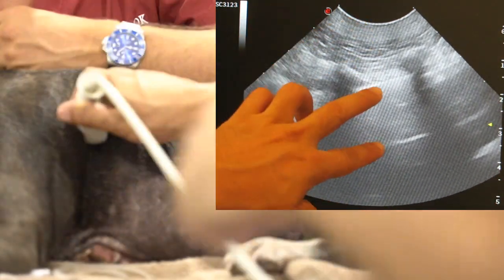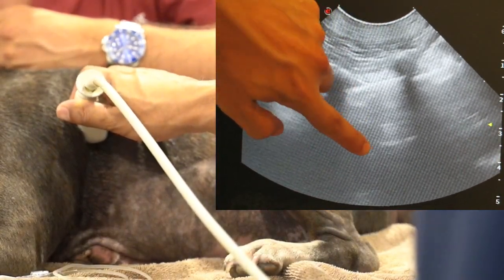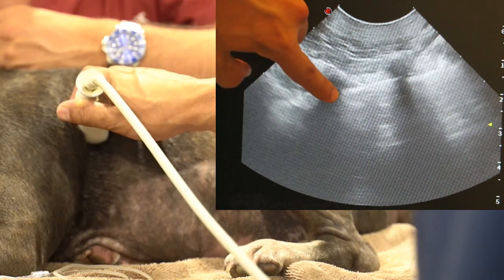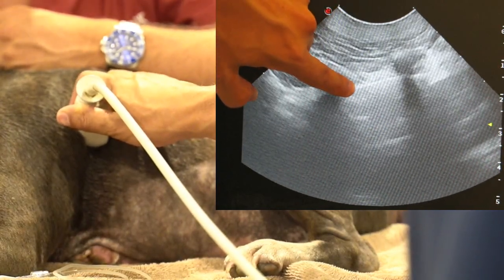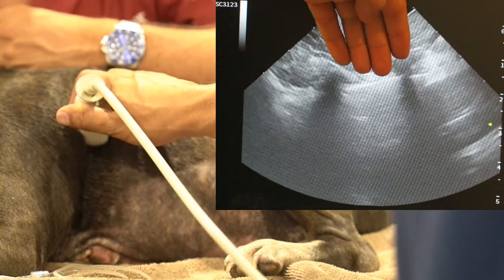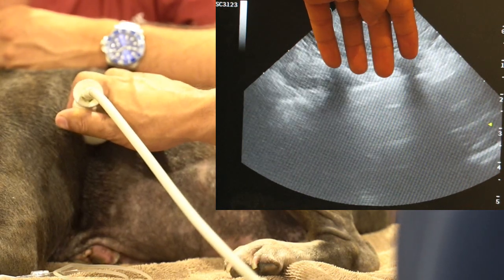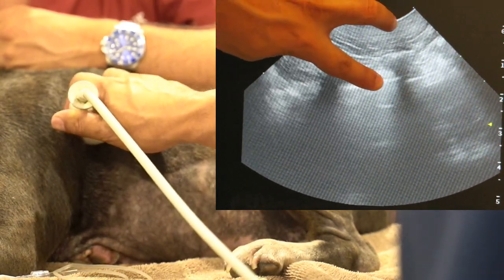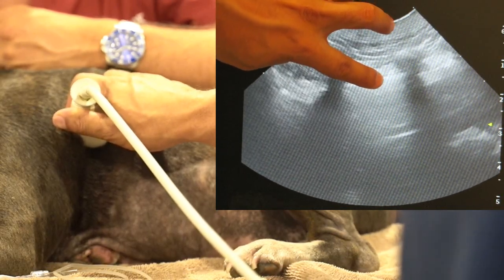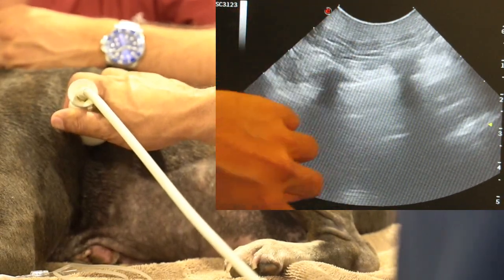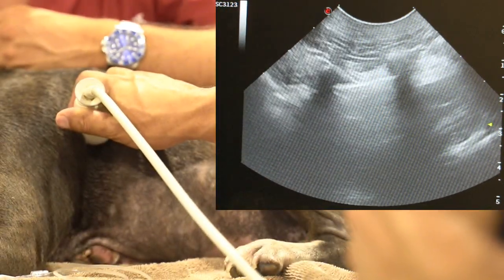There's a nice A line there. An A line is a reverberation of the lung-chest wall interface. The ultrasound beam can't see beyond that interface because it can't see through air, so it just reverberates and duplicates what it sees. That shows up on the ultrasound screen as these bright horizontal lines, indicating that there's air in that particular area of the lungs.